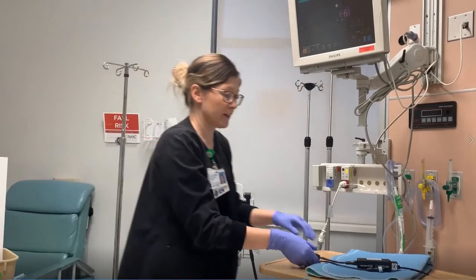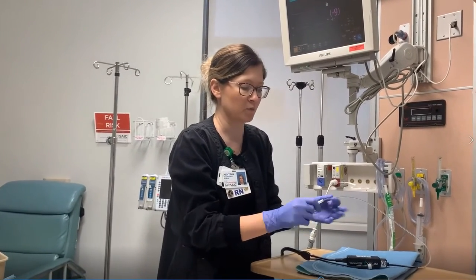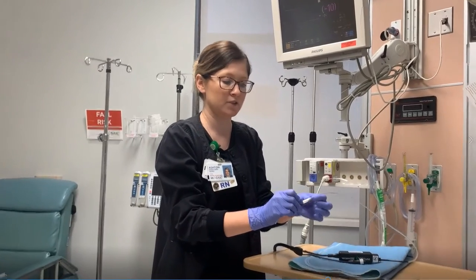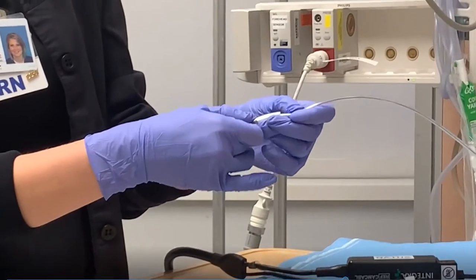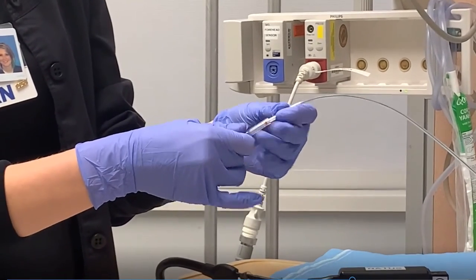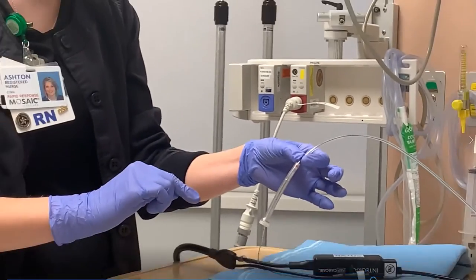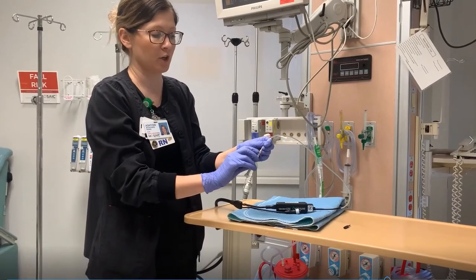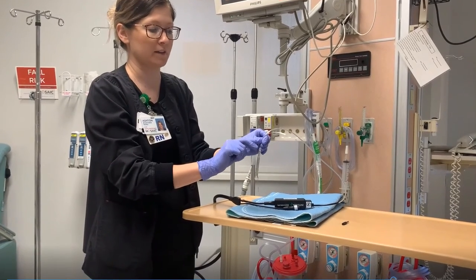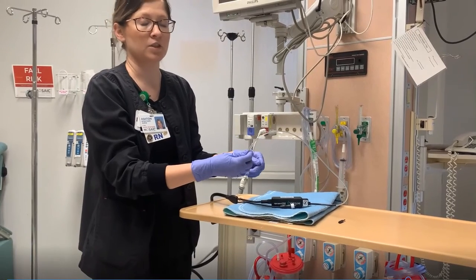Per the manufacturer guidelines, they want this red line in this sheath here. Just let the surgeon know if it would come out, but ultimately it's the surgeon's decision. Make sure you're communicating where this red line is so we know if it comes out. Sometimes people will mark on the catheter here so that if it would come out, we would know.